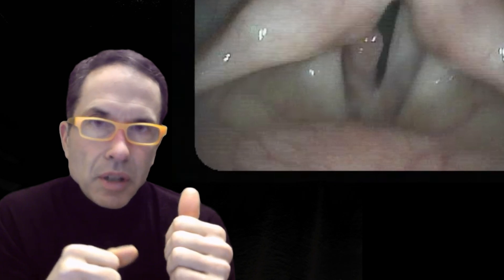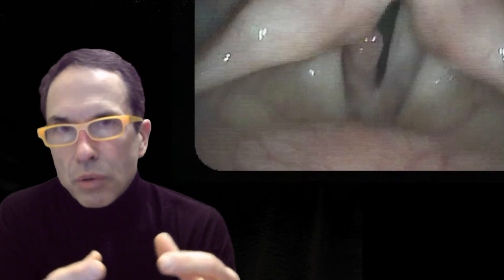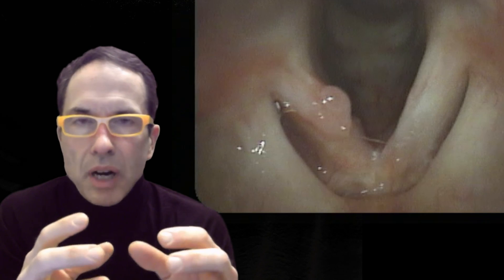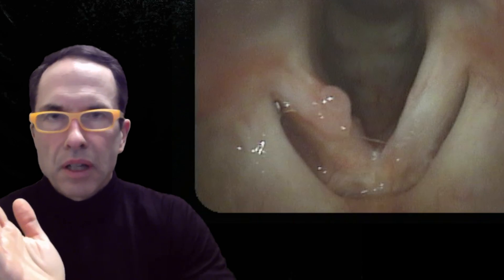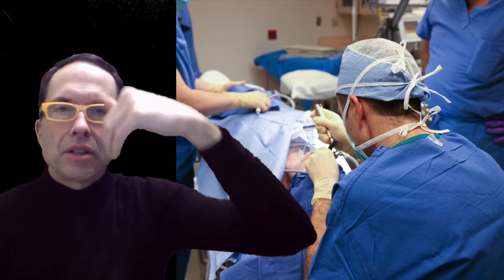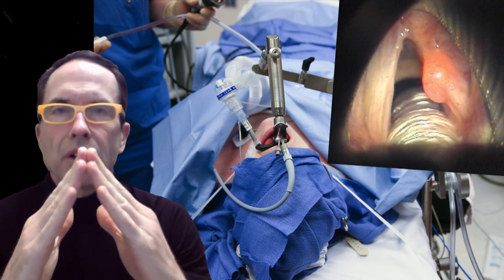She wants it off to improve her voice, and we also want to remove it because it's a growth that will keep getting larger, and we want to prevent it from coming back if possible. While in the office, the vocal cords are viewed upside down — with the front of the voice box at the bottom of the screen. In surgery, with the surgeon sitting behind the patient looking forward, the vocal cords are viewed with the front at the top of the screen.